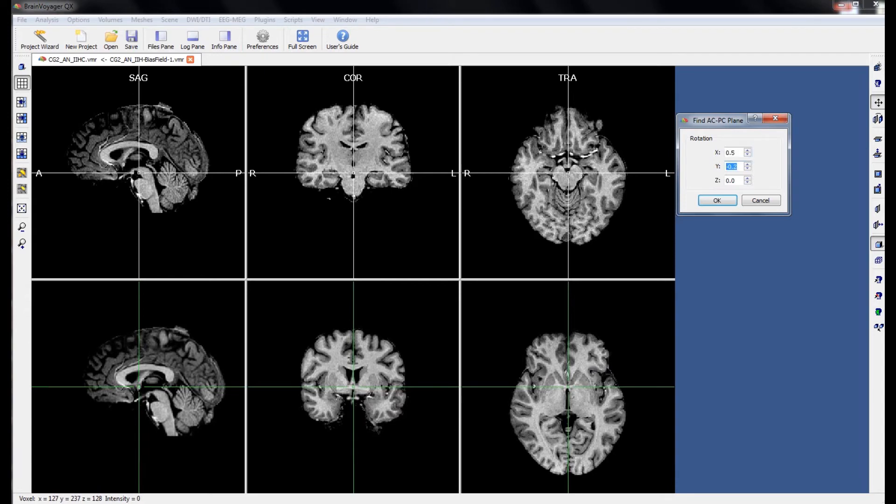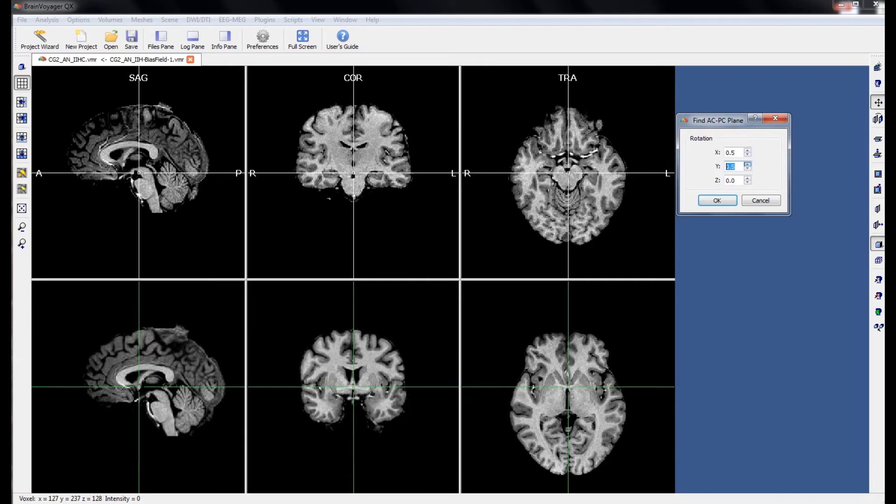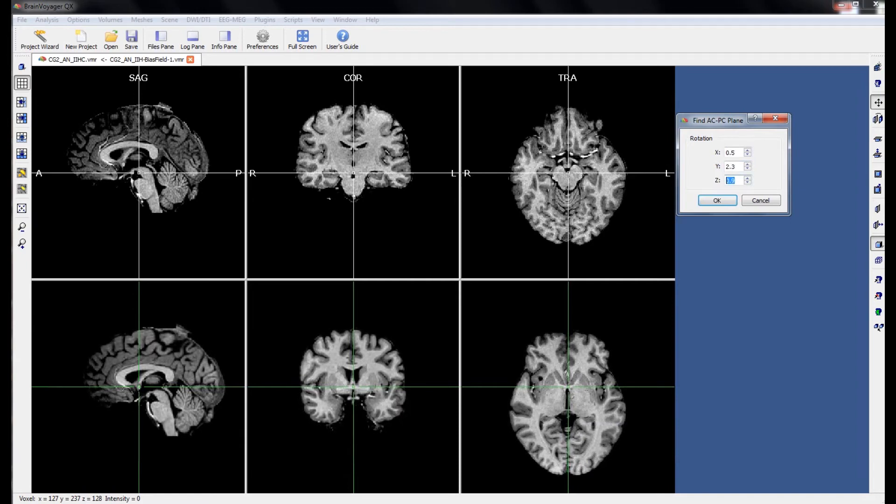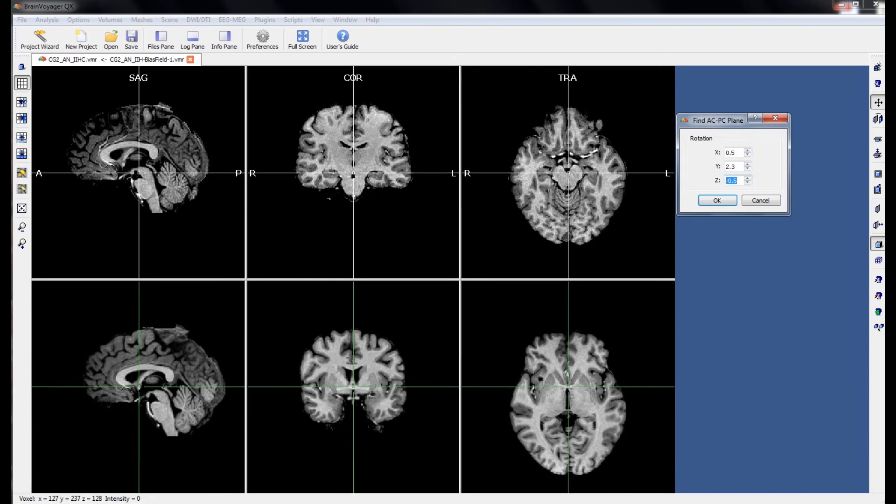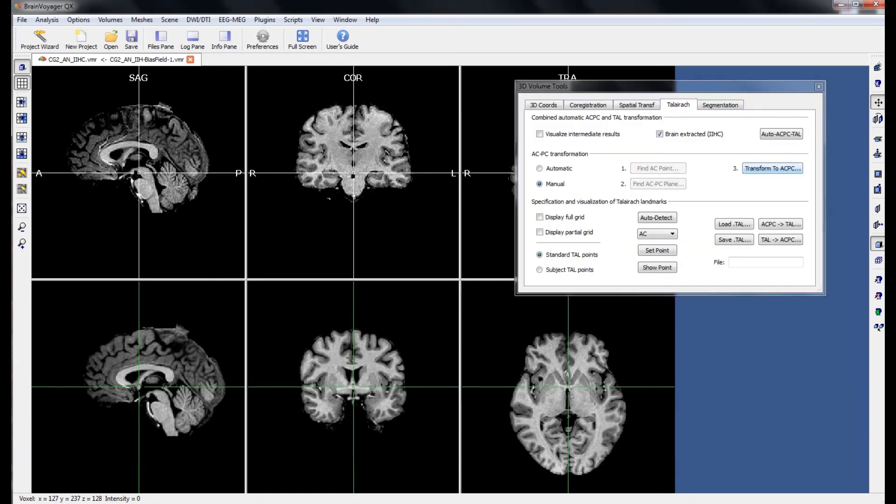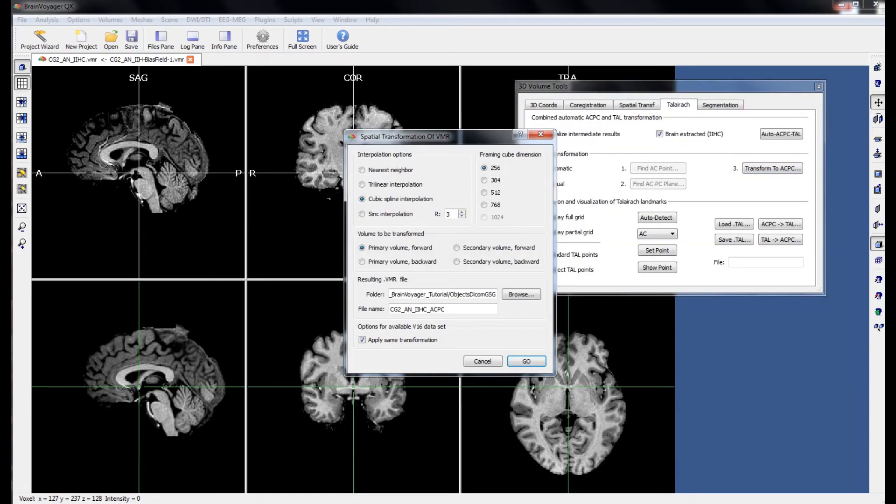Finally, we can make changes to the Y and Z rotations such that the brain is symmetrical about the horizontal and vertical axes in their respective windows. Once we are happy with our corrections, we can transform the brain to ACPC space.